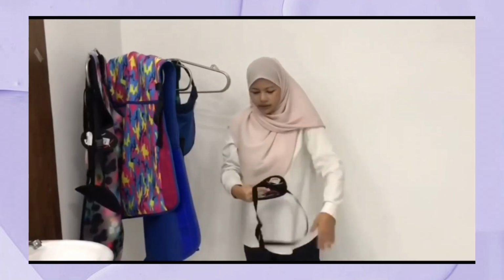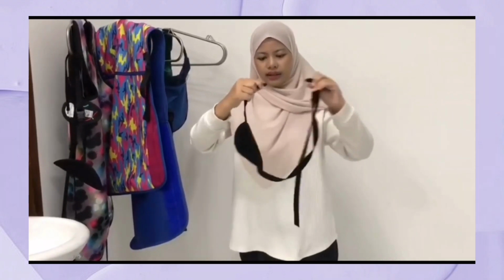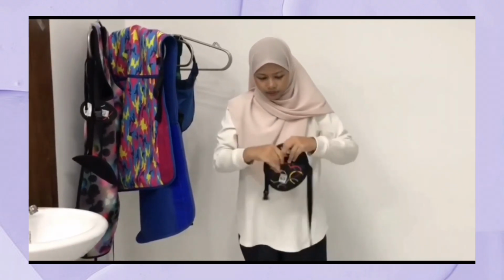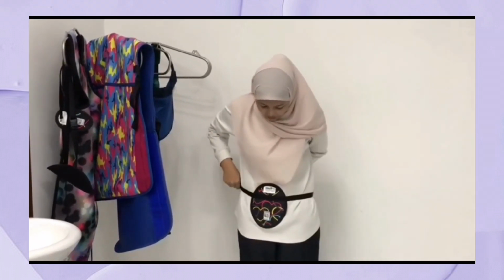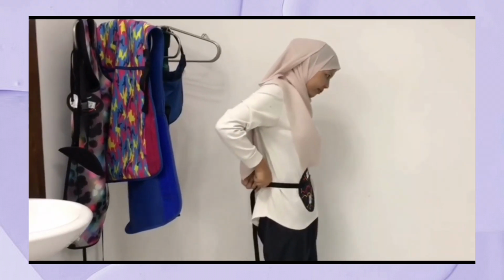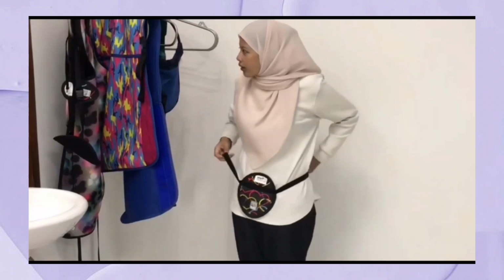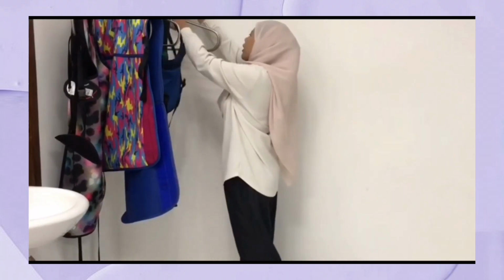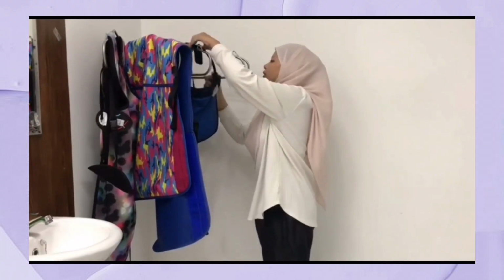This is the gonad shield. And place it in this area. Okay, click. Okay, then. Other than that, we have this shield.